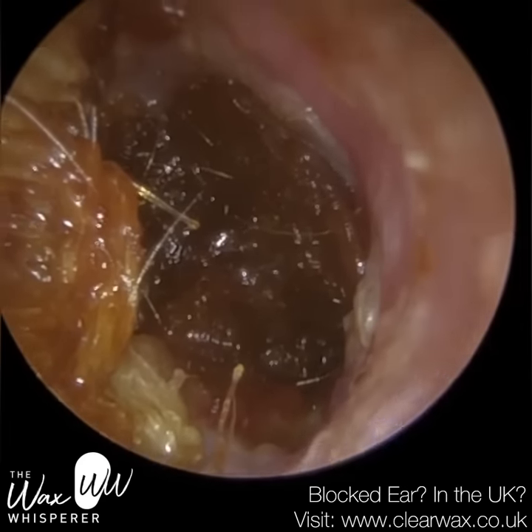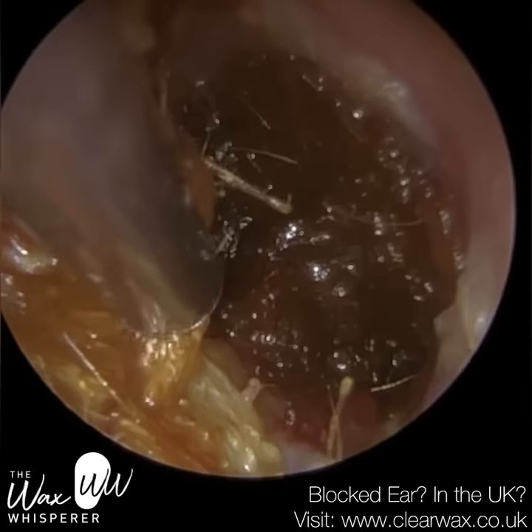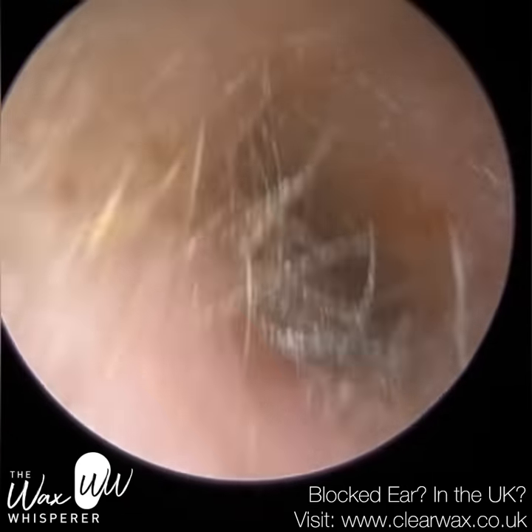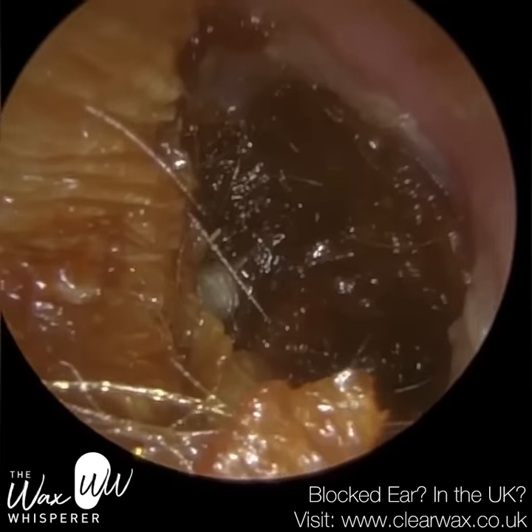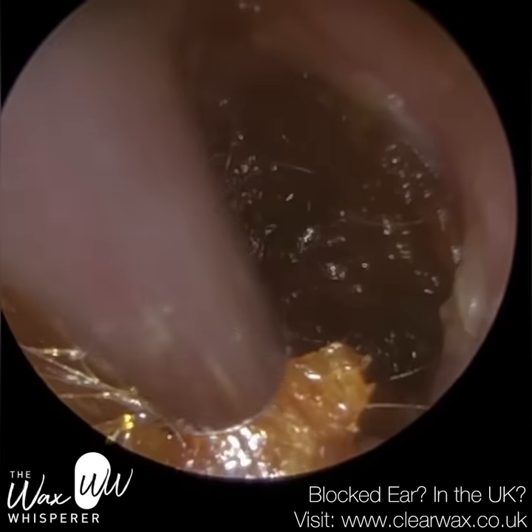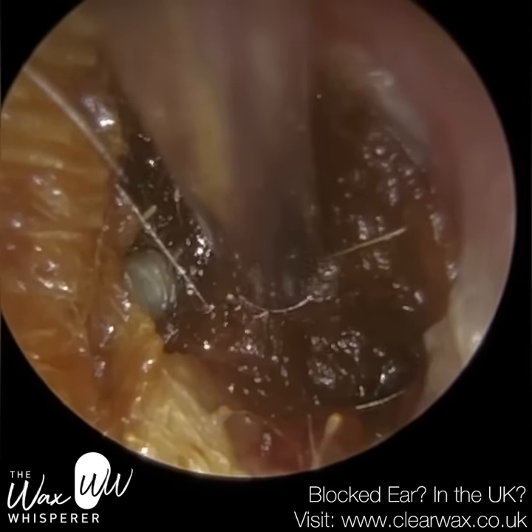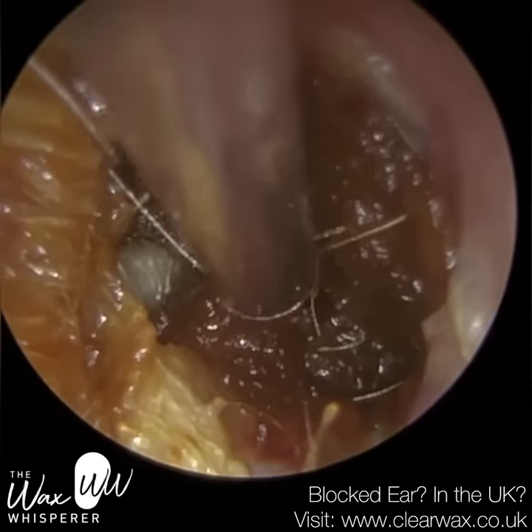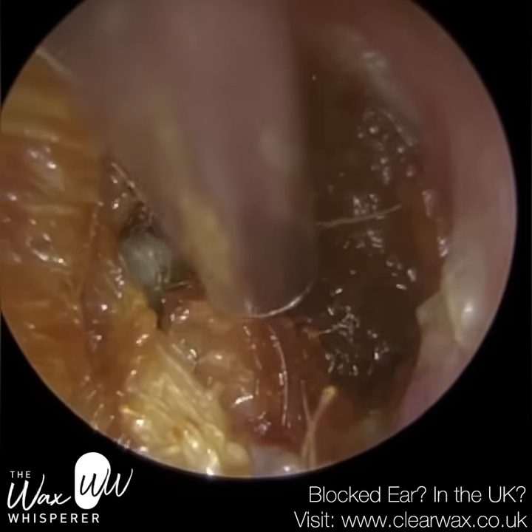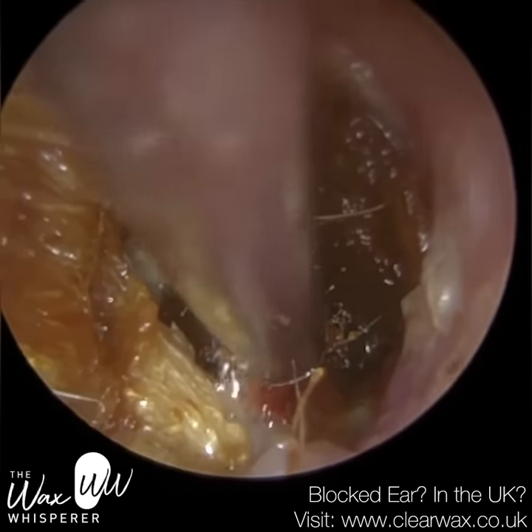We're getting a bit of clarinetting. For anyone who is new to the channel and hasn't heard the term clarinetting — sometimes when you perform microsuction and you get a hold of a bit of dead skin, that skin begins to violently flap at the tip of the suction probe, and as a result it emits a very loud, high-frequency squeal. It's not only loud for the patient, it's loud for myself. So a fine end suction probe is an extension to the normal suction probe — we attach it to the end and it's got a narrower diameter.